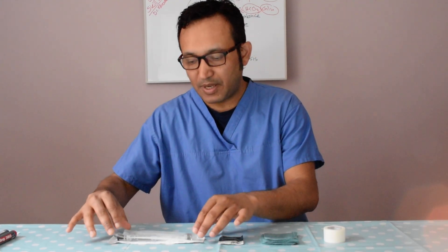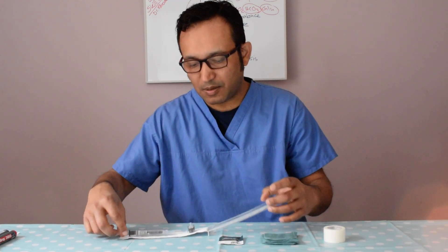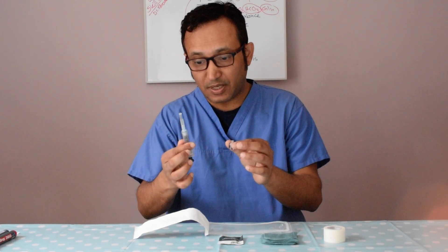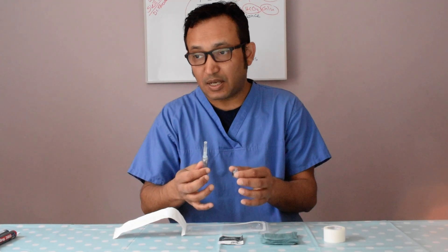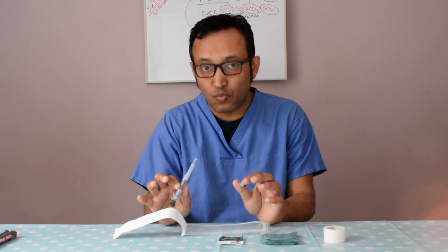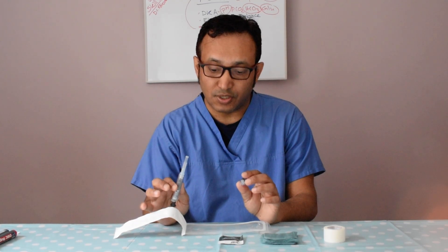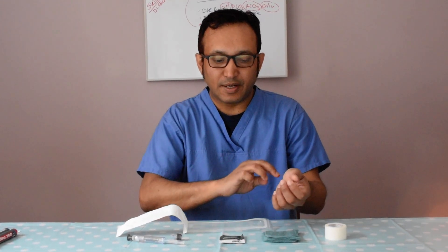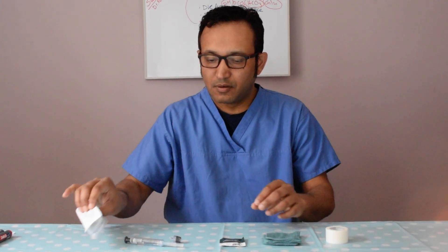We have ABG syringes that come in prepacks. When you open the pack, it comes with a filter syringe and a lock system. We probably don't have these prepack ABG syringes in Bangladesh, and I believe this is something we need in every hospital there. We also need clean prep, gauze, and tape.